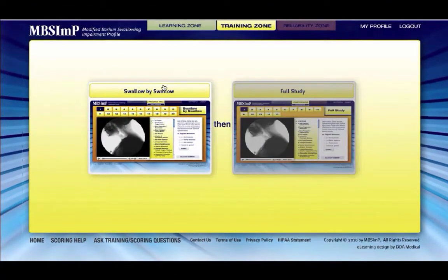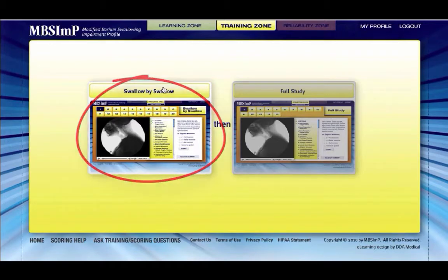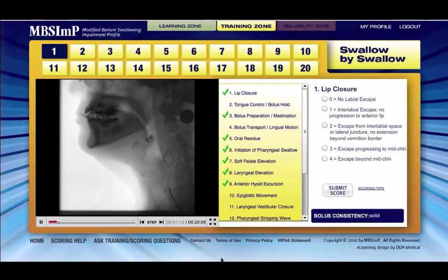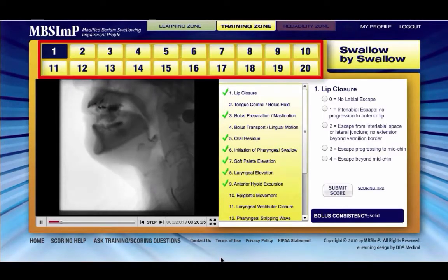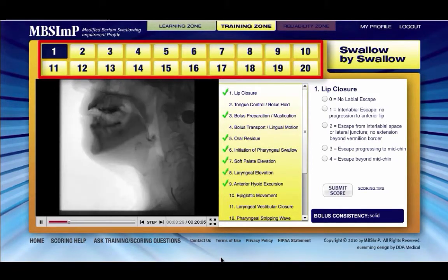The training zone is divided into two sections: Swallow by Swallow and Full Study. The second is locked until the first is completed. In the Swallow by Swallow section, each component is scored on 20 individual swallows taken from MBS-IMP protocol studies.